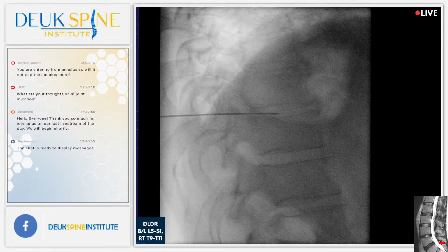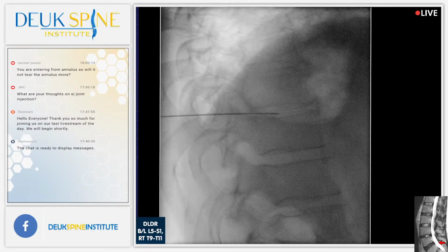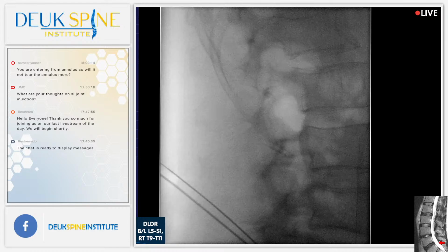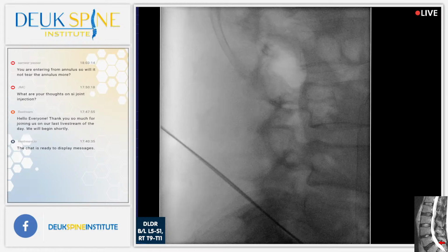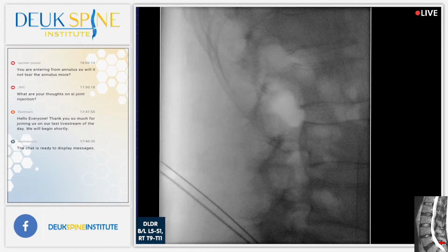All right, let's just all verify we're at the right place, okay? Because if I know for sure I'm at 10, 11, which I believe I am, let's count from south up. Let's just try, okay? Shot. A little bit. That's got to be 5 right there. Shot. So now go north a little bit. Right there, shot. All right, a little more north. So it's 5, 4. I see 4. Shot. 3, 2. Hold on. 1. Go north.